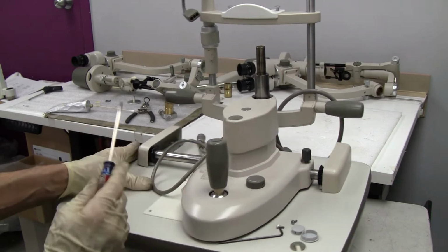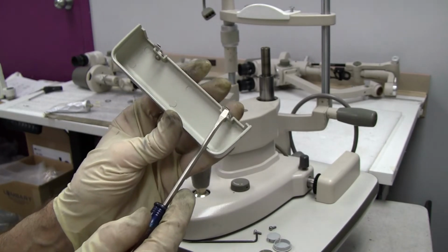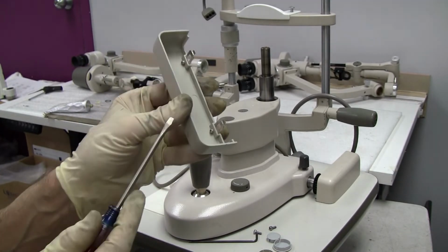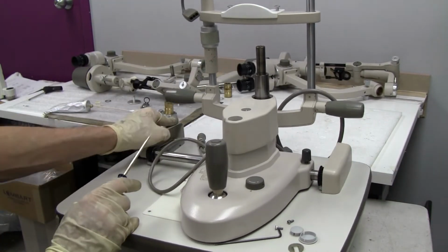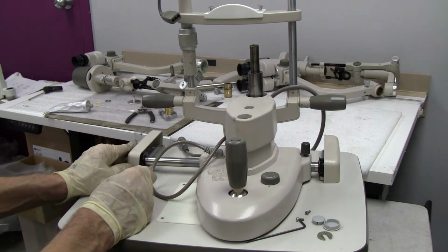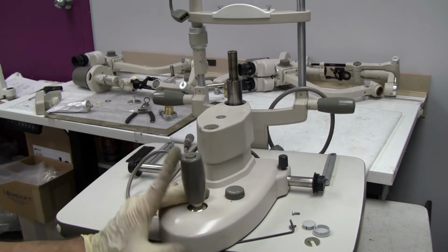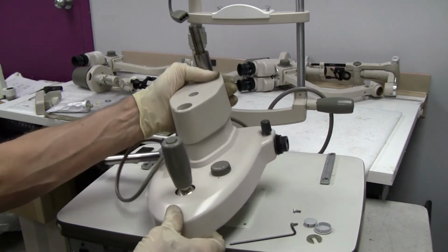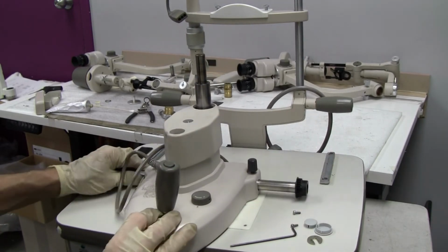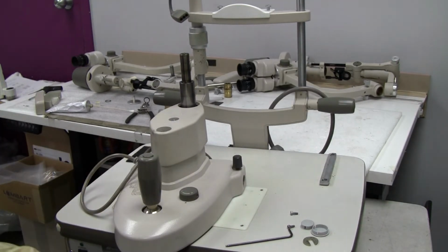In case you don't know how to get the rail covers off. Little pins right here. You push down on them with a screwdriver and then they can slide away. So you push down and pull away. Now, since you're going to be taking the base apart, you can take your axle out right now too. Can take your axle out.